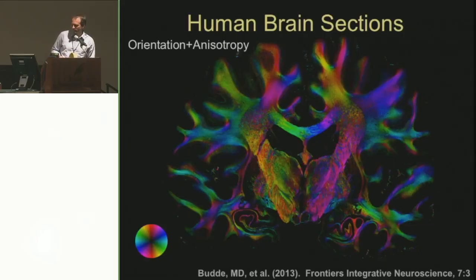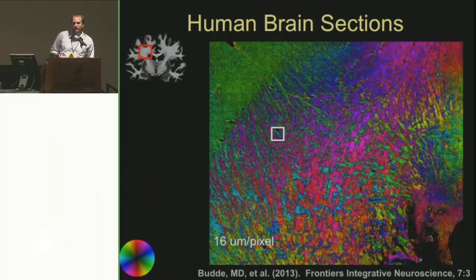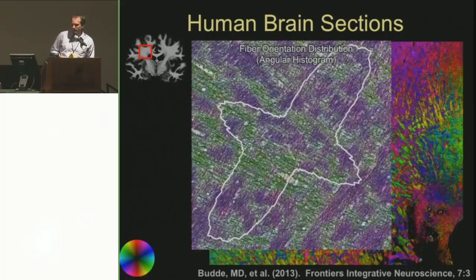And so I'll step through some of the examples here. One of which is the region here where we have multiple intersecting fibers, and you can see how in the color maps here you can really start to appreciate just the microscopic detail that one sees here. And at the actual acquired image resolution, these are again color-coded by local orientation, you can just see how interspersed and interdigitated these different fiber bundles are. So it does speak to one element that even if we're using DTI, image resolution alone will never get us down to the level of individual fiber bundles. We need some model that captures different fiber orientations within a single voxel.